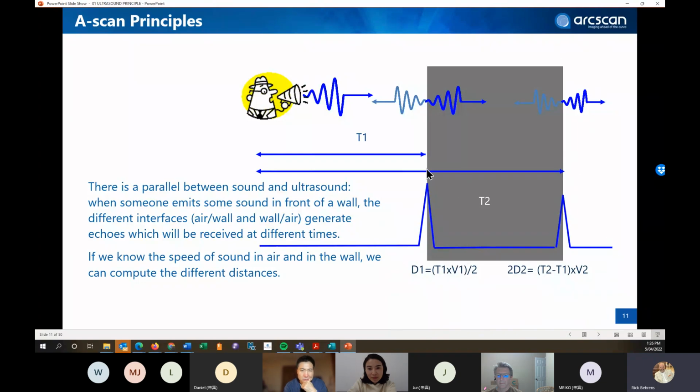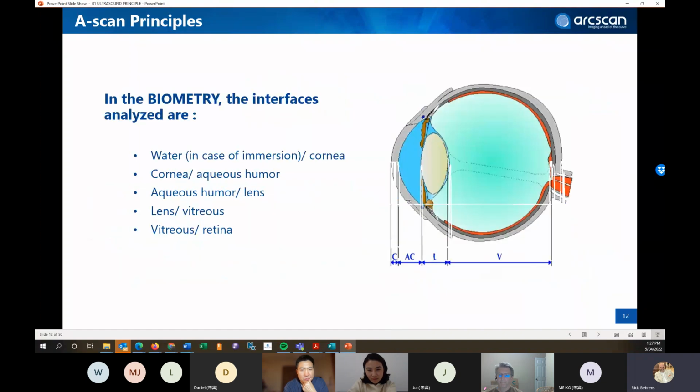And we measure that in time. So we know that the ultrasound is traveling and is measuring time. We know that we hit the first gate in 1 second and the second gate in 1.1 seconds. And because of the speed of the sound wave, we know the distance between one and the other.